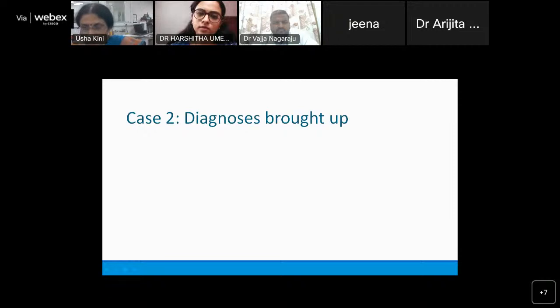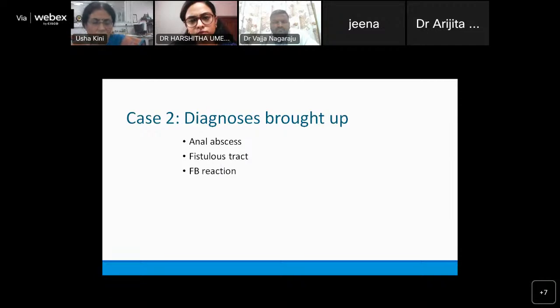So to add to your differentials, there were a lot of other diagnoses which were brought up in the group. Someone simply said it's an anal abscess. Okay, a lot of inflammation, must have been a ruptured abscess. Okay, fistulous tract. The surgeon himself will tell you that there was query fistula. So I don't think our diagnosis should be a fistula, right? He wants to know, having sent the fistula tract, what is it that you want to say on this patient?